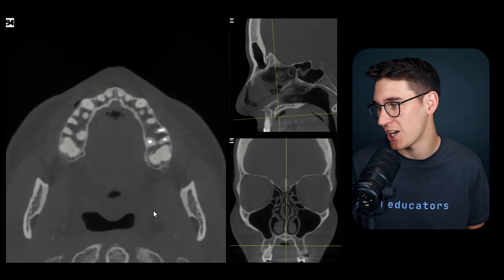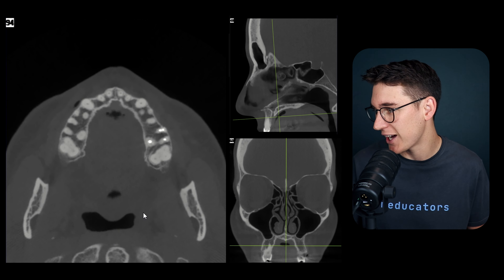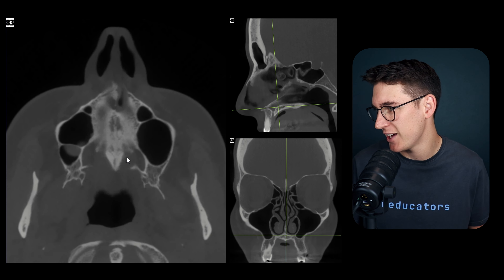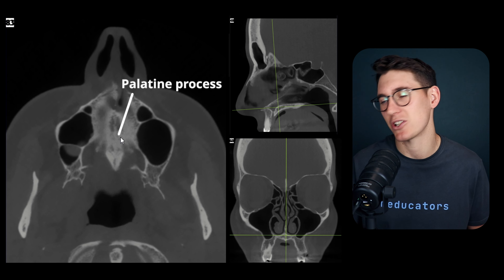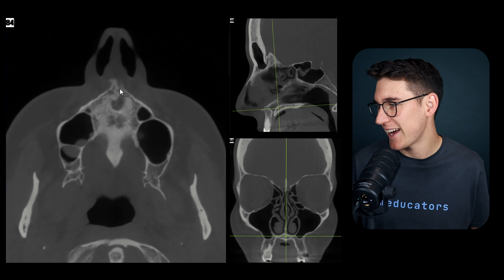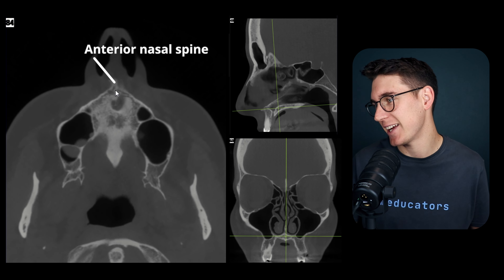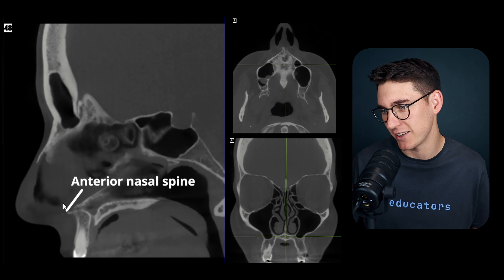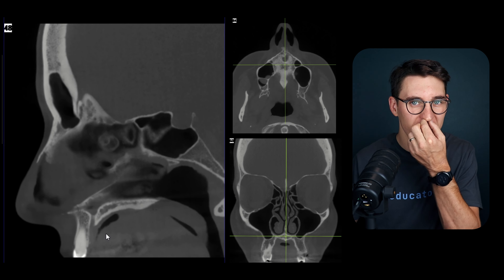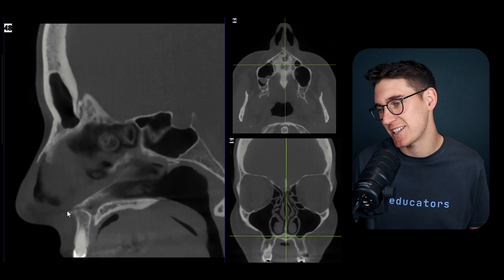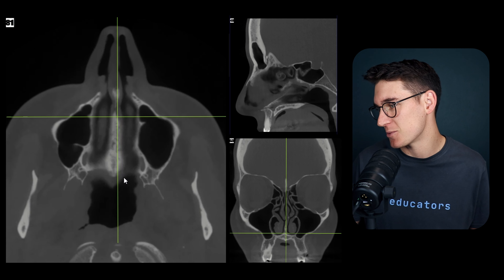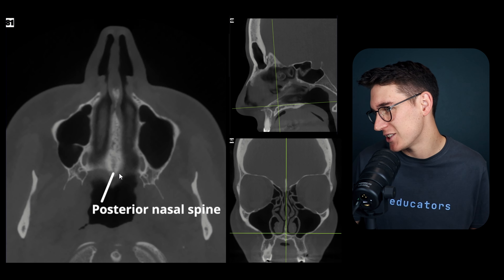On the axial slice we can scroll to the palatine process and see it in cross-section. Anteriorly there is the anterior nasal spine, lying just below the opening of the nose - you can actually feel this bony projection. There's also a posterior nasal spine when we look at the palatine bone.